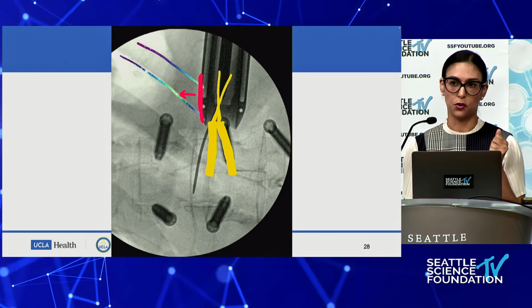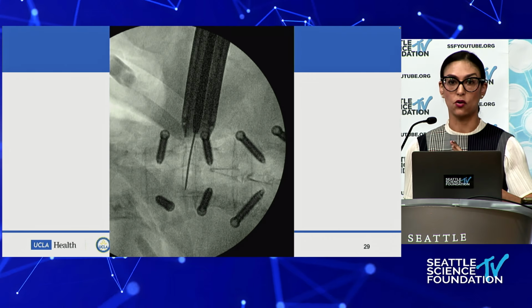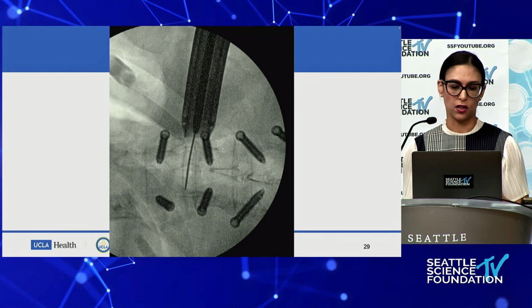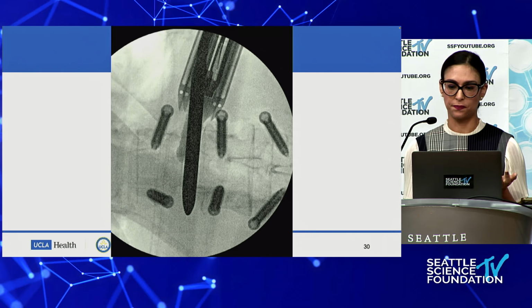If you just endlessly push there, you can end up breaking a rib. So the solution is essentially to, paradoxically, angle the retractor a little bit more, so you sneak in under the rib. This way you're not really fighting it, you're sneaking under it, and your trajectory is much more straightforward. And the angled instruments can also help with this.